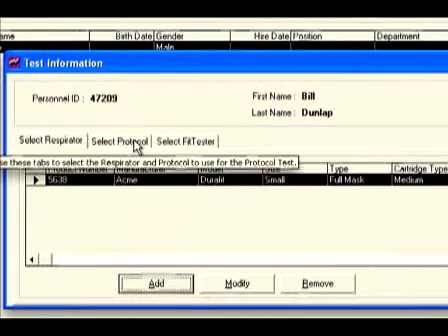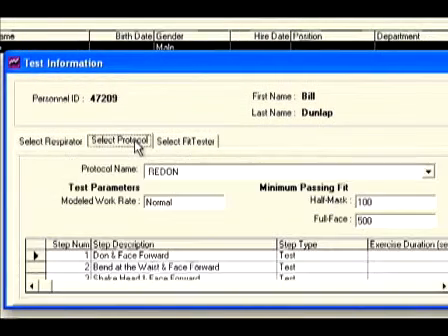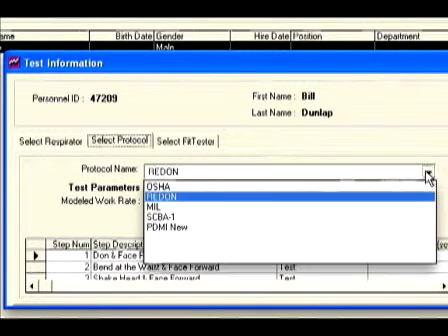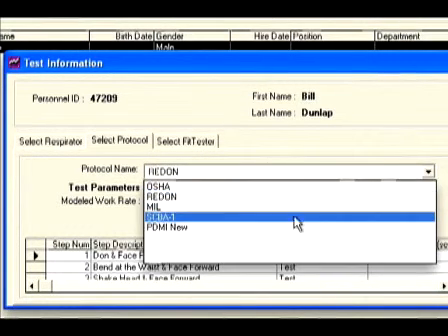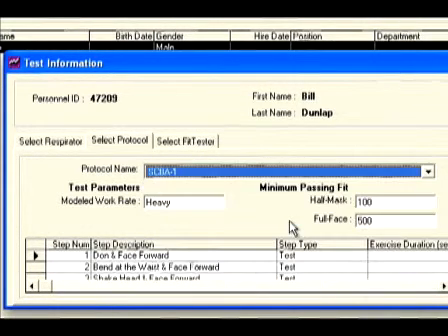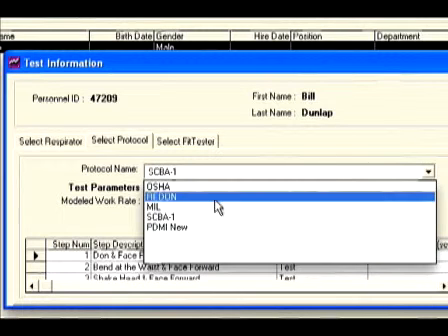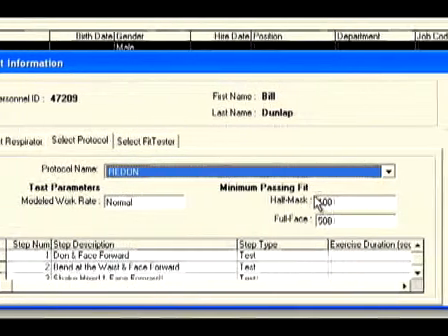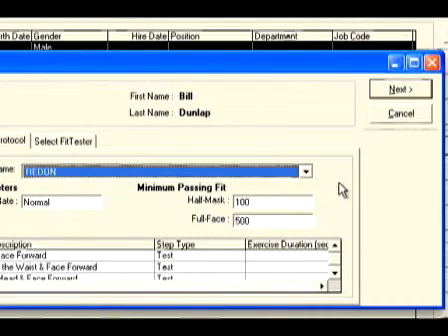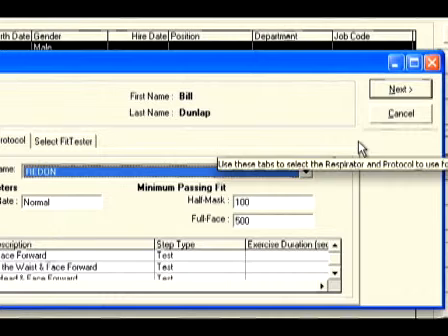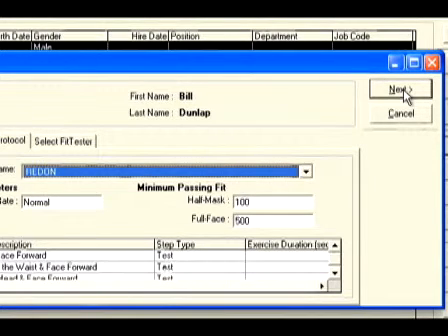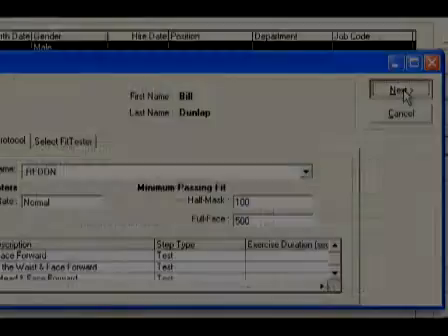Click on the middle protocol tab to select the protocol you would like to use for this test. The protocol you select will become the default protocol on future tests until you change the protocol selection again. When finished, click next.